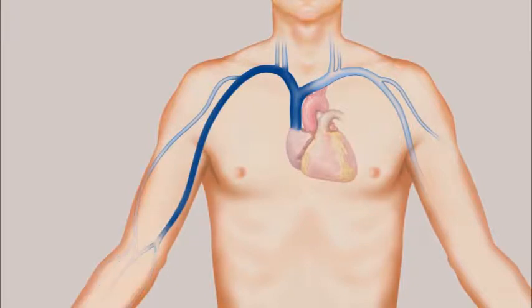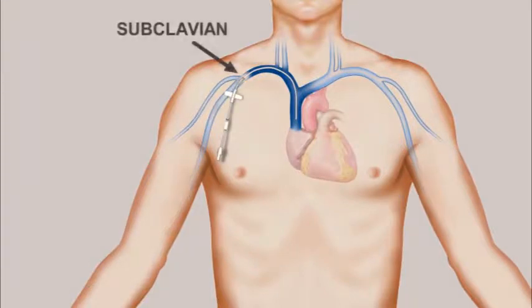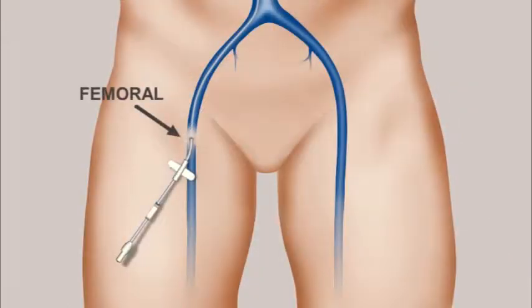The CVC is a small tube placed in a vein and then threaded into the largest vein in your body. The CVC is usually inserted into one of three locations. The PICC line is inserted into a vein in the arm. The subclavian is inserted under the collarbone. The femoral is inserted into the groin. Your doctor will decide which type is best for you.